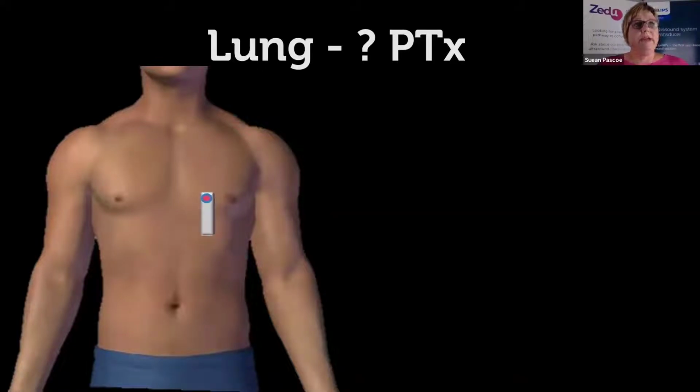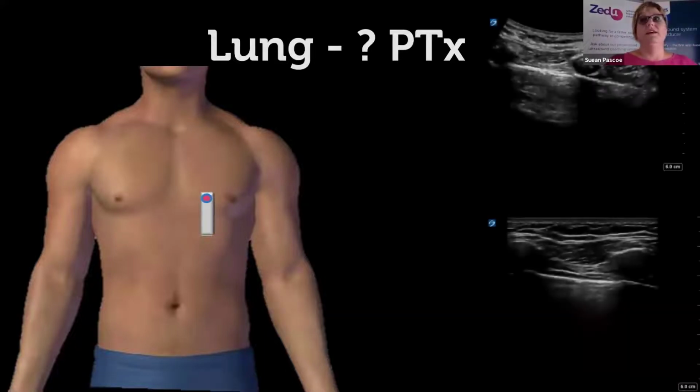It's interesting, one of our patient models the other day was ever so kind. He had a bit of chest pain, but didn't think much of it. But he was a healthy young chap, 21 or something, and had a spontaneous pneumothorax. It looked enormous on ultrasound, but he had an X-ray and they could hardly see it. So it just goes to prove how sensitive ultrasound is for picking up pneumothoraces.